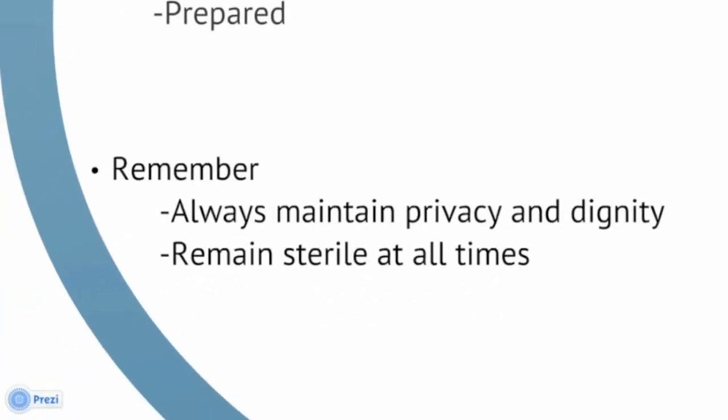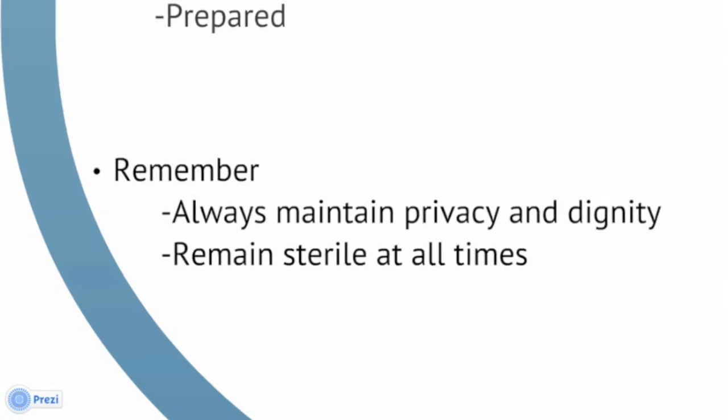Remember, always maintain privacy and dignity of the patient throughout this procedure. There are a large number of steps involved in catheterisation. However, you should concentrate on remembering that the aim is to remain sterile at all times to reduce the risk of infection to the patient.